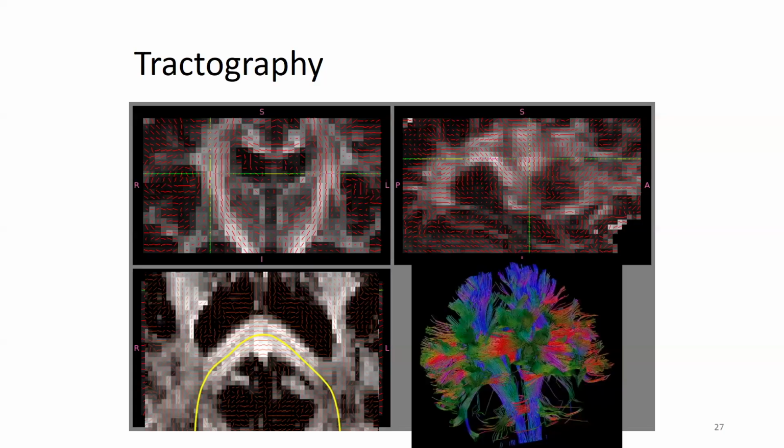And when I do that for all the voxels, I can get things like this. In these graphs, you see all the fibers shown in the same color indication. So blue is again the fibers going mainly from top to bottom, red from left to right, and green from anterior to posterior.